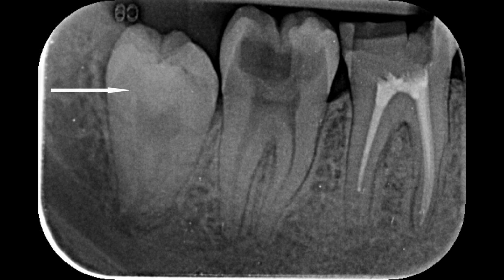Here you can also see the vertically impacted wisdom tooth, by which you can imagine the position of the second molar and the complexity of the case.